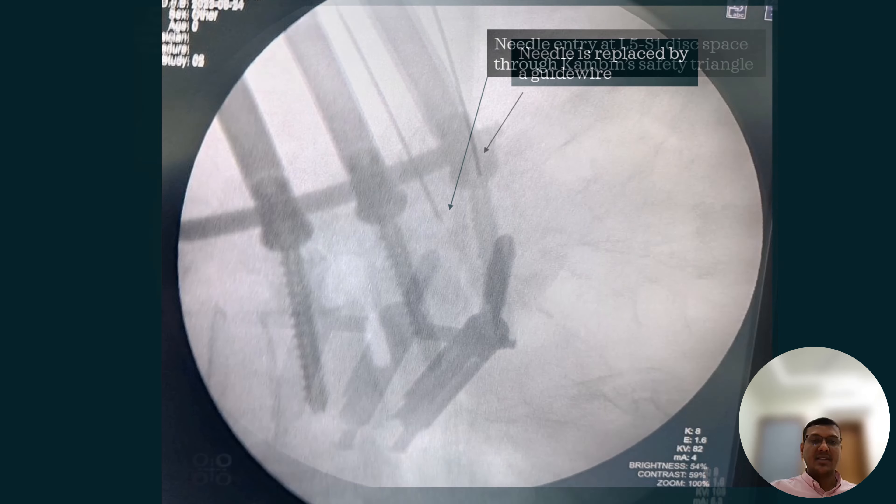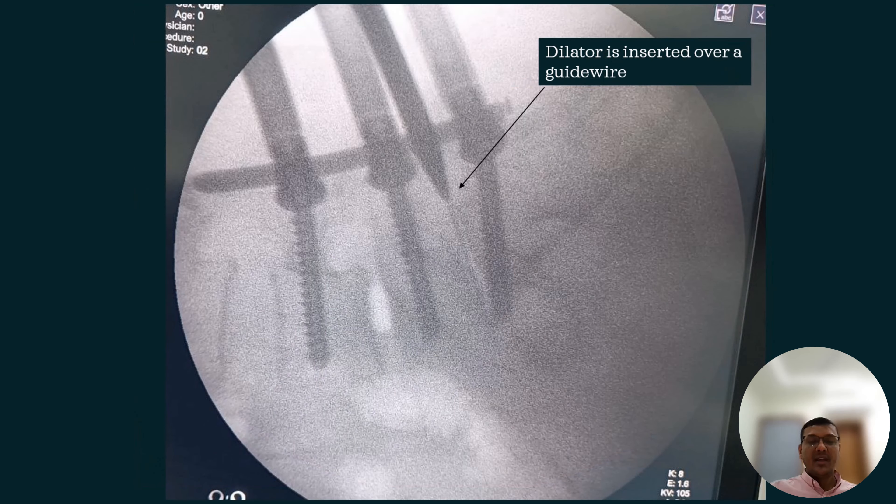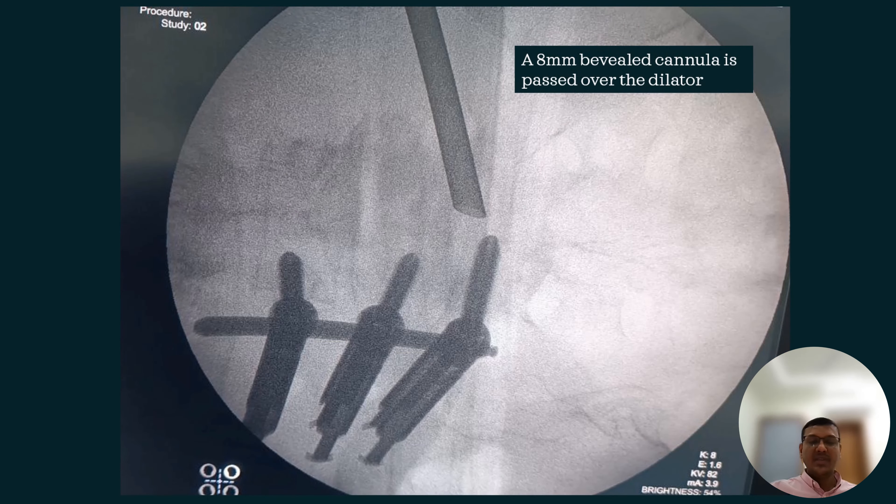Access to the disc space is made under X-ray guidance by insertion of an 18-gauge, 20-centimeter-long needle. Then a guide wire is passed through it, and over that we pass the dilator, over which we pass this 8mm beveled cannula.